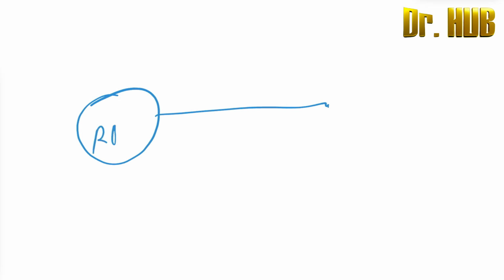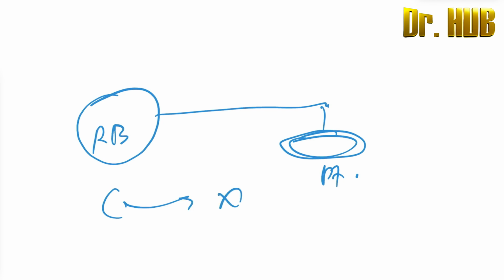Next, so we saw the Mapleson A, Mapleson B. Now let's move on to the Mapleson C. So Mapleson C, this is easy to remember. So C for the corrugated tube, right? So this will be the reservoir bag, and then towards the patient we have the mask, that is towards the patient side. So here there is no corrugated tube. So C means there is no corrugated tube.